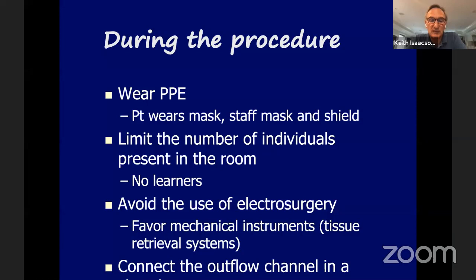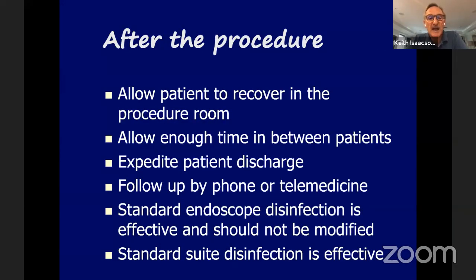We don't use a lot of electrosurgery in the office. I enjoyed the talk from Karl Storz that discussed the 5mm bipolar resectoscope, and I do use that in the office, but it's used fairly infrequently. After the procedure, we just allow the patient to recover in the procedure room. We don't use any anesthesia, no local or oral anesthesia except non-steroidals. When a patient has completed her procedure and is done with her cramping, which takes about 5 to 10 minutes, she can get off the table and go back to her normal activities.